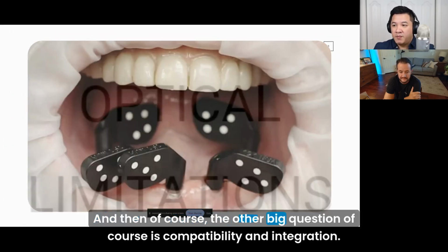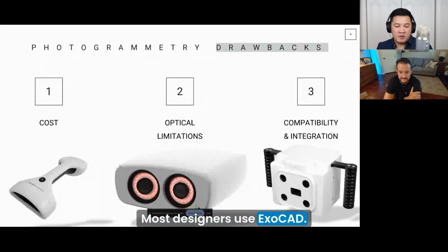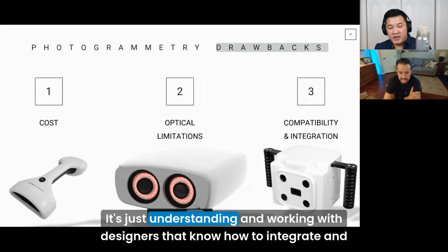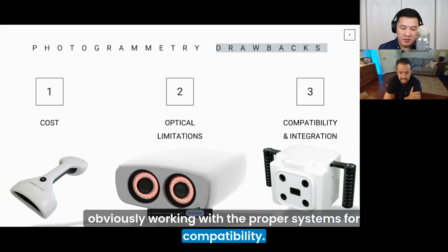And then, of course, the other big question is compatibility and integration. Most designers use Exocad. I'm a big 3Shape guy. You can use it with any system. It's just about understanding and working with designers that know how to integrate, and working with the proper systems for compatibility.